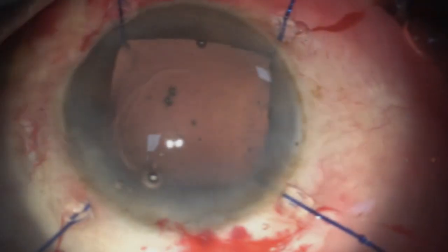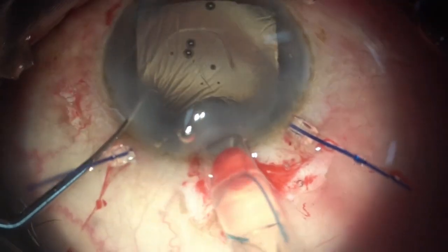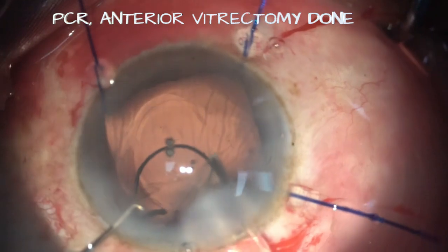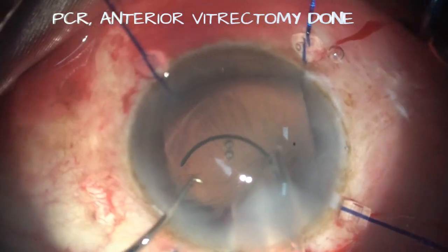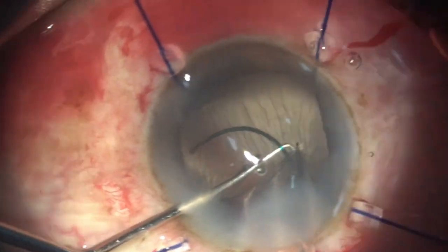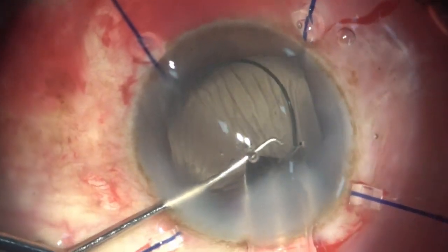This is the second case scenario, where the question is, why is the IOL decentered? A trainee surgeon operating with a small rhexis less than 4 mm and a PCR occurred during hydrodissection, which was noted during the last piece phacoemulsification.